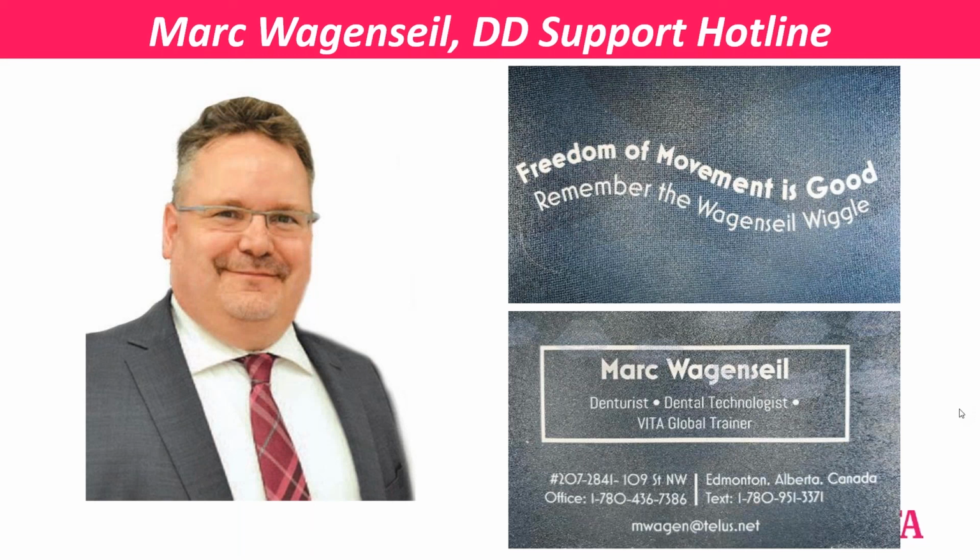All right. Got a question from Shannon. In order to properly achieve function in the unique chewing cycle, the equilibration and milling in excursive movements after processing must be done intraorally, correct? Yes, correct.